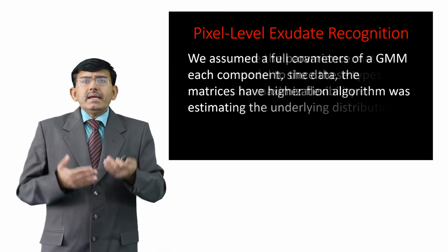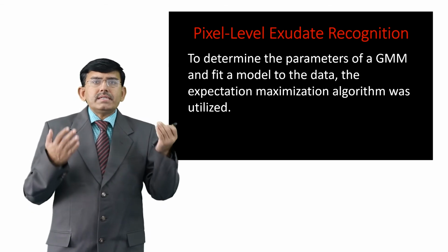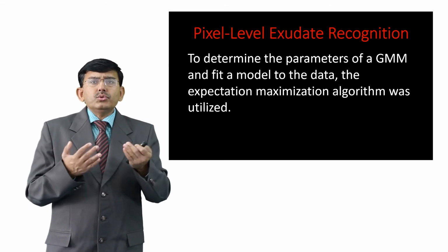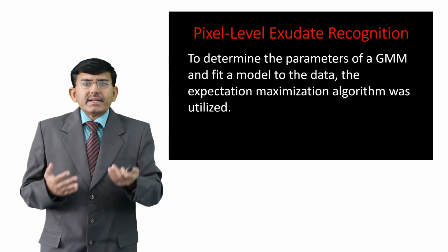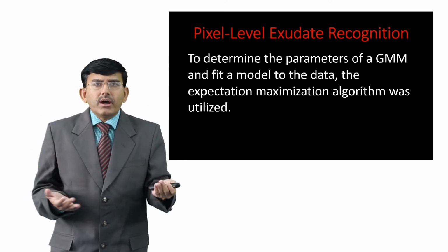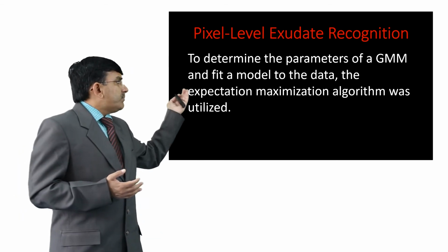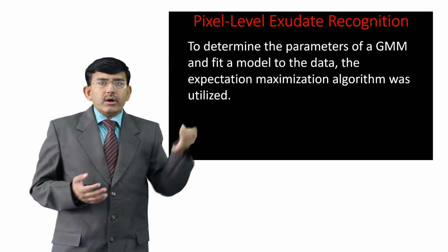To determine the parameters of a GMM and fit a model to the data, the expectation maximization algorithm was utilized.